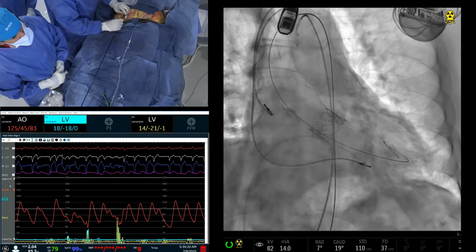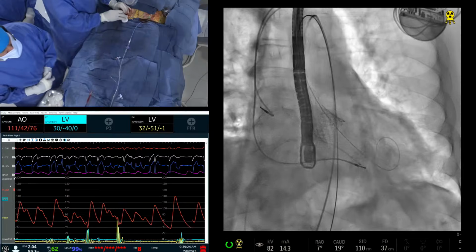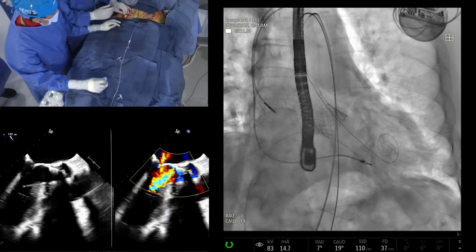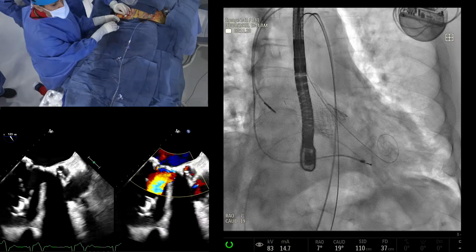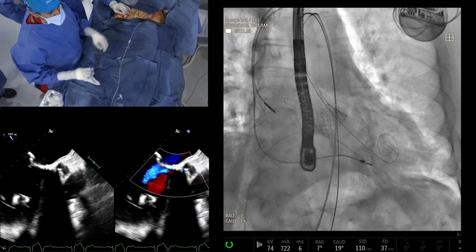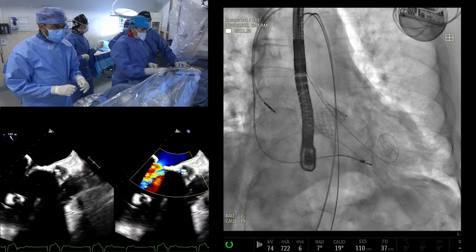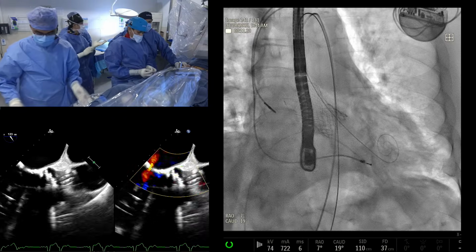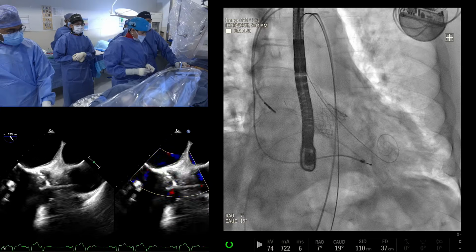You got the wire? Okay, put color. Look at that. Still there, but better. Mild. Even if we started with a 26 S3, originally this would be kind of our expected result, right? Because of the calcium, you don't want rupture either. At the end of the day, you cannot fight calcium.